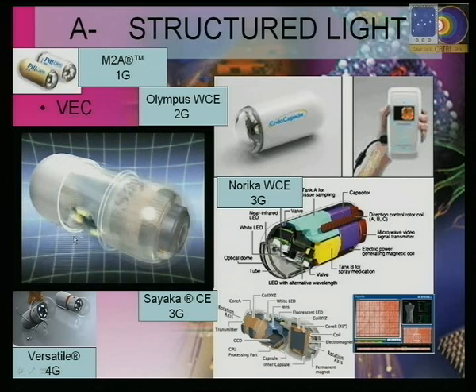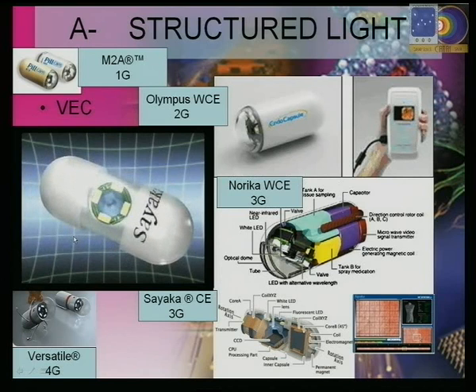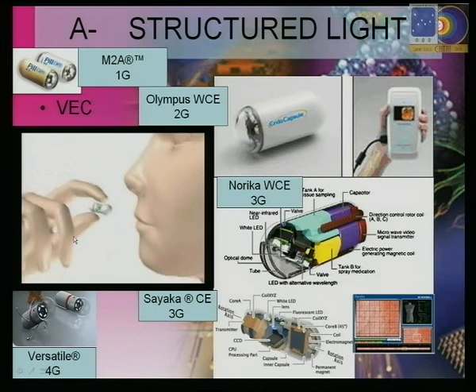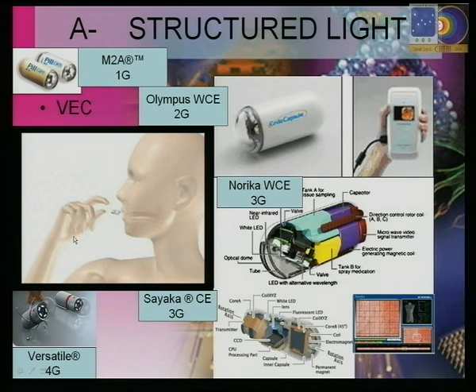This is only useful for the small intestine because the lumen is relatively small, but in the large intestine the pill moves around and gets lost. If you are lucky, you can have some pictures, but probably not of very good quality.